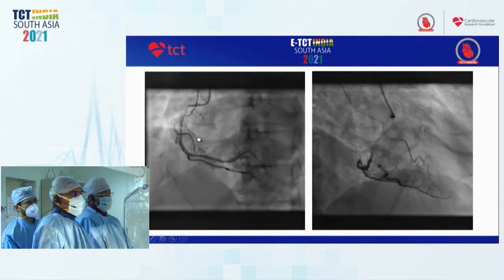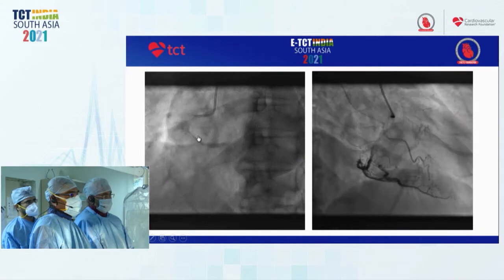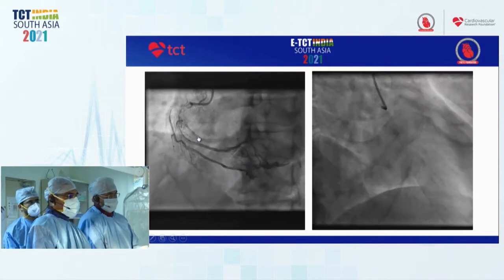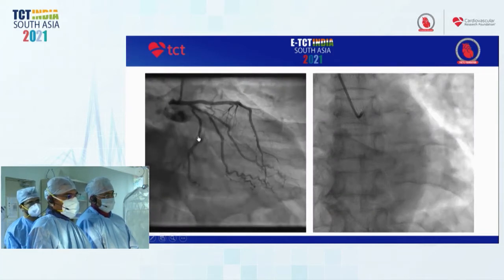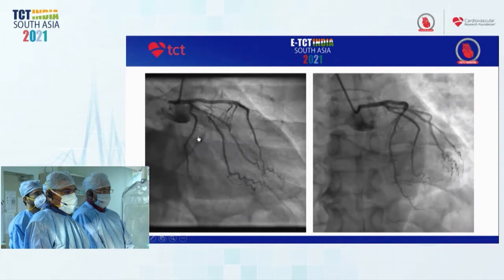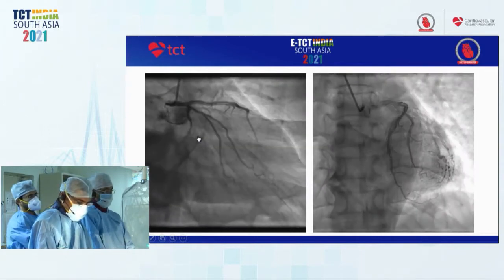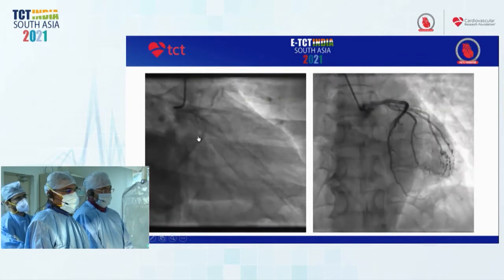And then we went to the left shot. Before we did the left, we just checked an RFR on the right side, just to be sure. I will show you the left after this. Okay, so you can see the left shots now. There's a tight left main disease there on the ostium. The stent looks okay on the angiogram. And as I told you, the right seemed to have some disease. So the plan was to check the right, whether that is flow limiting, and then obviously tackle the ostium of the left main.